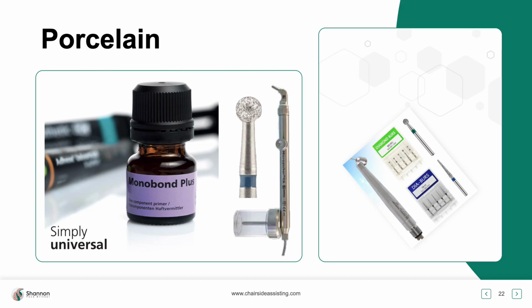But this is why, again, it's so important when we get to the hands-on to make sure that you're utilizing a very heavy, strong composite, one that has a lot of strength, heavy body, not some wimpy flowable, which you'll be able to feel when you go to place it into your attachment template. But one of the things that I want you to really think about is wear and tear.